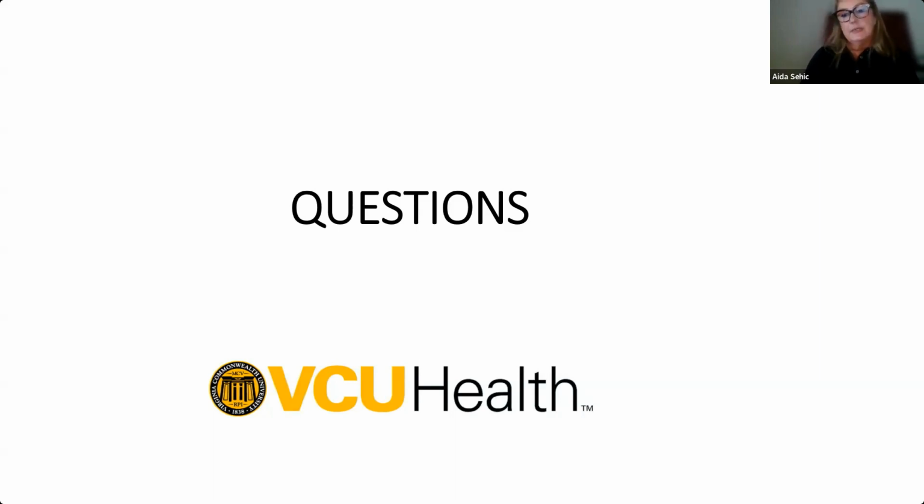Before we start questions and discussion, I would like to explain why I decided to prepare a presentation on air emboli detection during cardiac surgeries. Air emboli are almost inevitable during cardiac surgery. A question that I get from surgical teams is, if we know there will be air emboli during a procedure, why perform TCD monitoring? What can be done? With today's case examples, we presented that interventions are possible. It is possible to quickly detect it, and it's crucial to save patients' brains.